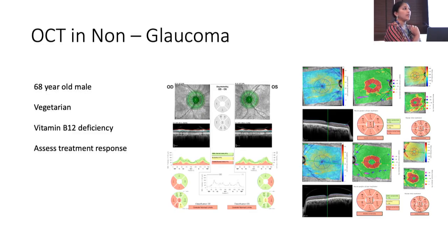As he was a vegetarian, his vitamin B12 assay was also done, which was found to be less than normal. Another importance of this case is that OCT of the optic nerve head and RNFL can be used to assess the treatment response to vitamin B12.